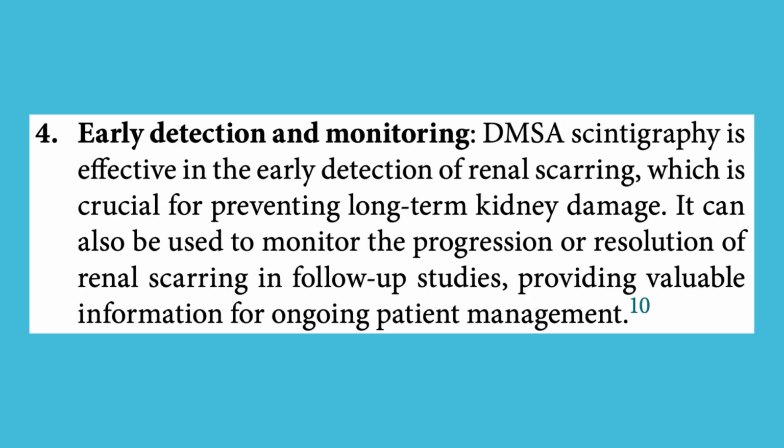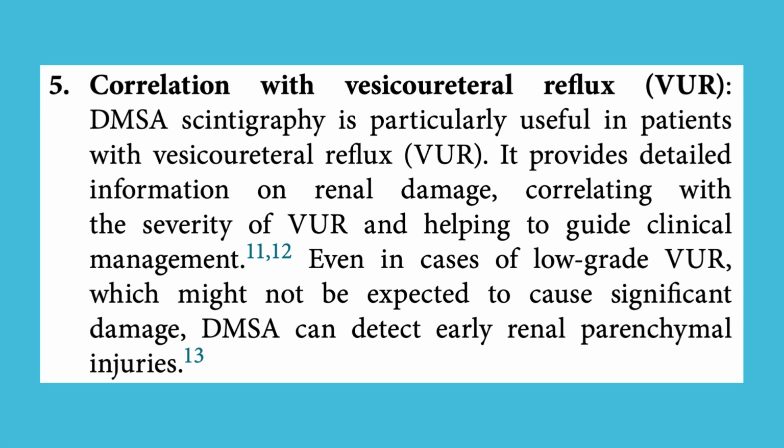4. Early detection and monitoring. DMSA scintigraphy is effective in the early detection of renal scarring, which is crucial for preventing long-term kidney damage. It can also be used to monitor the progression or resolution of renal scarring in follow-up studies, providing valuable information for ongoing patient management.